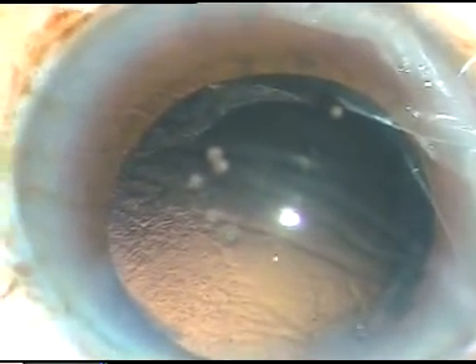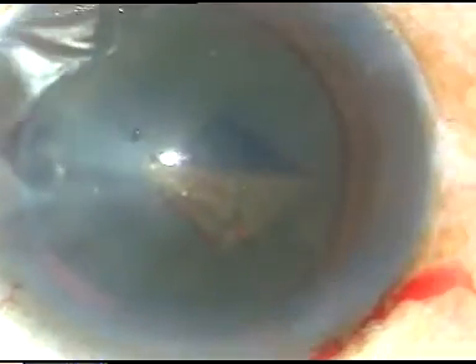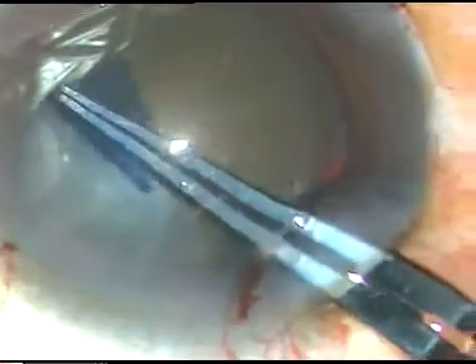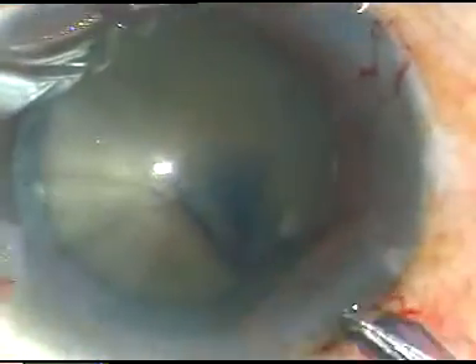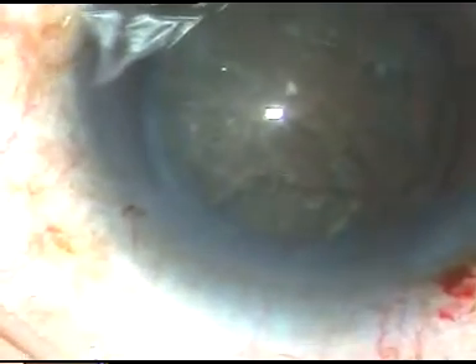And now we are going to see the third case. The capsule has been stained. Viscoelastic substance has been injected into the anterior chamber. We are going to do capsulorexis. Inside the capsule, raise a flap, then go with utrata forceps, hold this flap, and go anticlockwise. The margin of the pupil guides me — I remain at equal distance all around and perform a circular rexis comparable to femto-rexis. See the cataract is quite hard in this case — it is more than grade 4 and looks almost black.